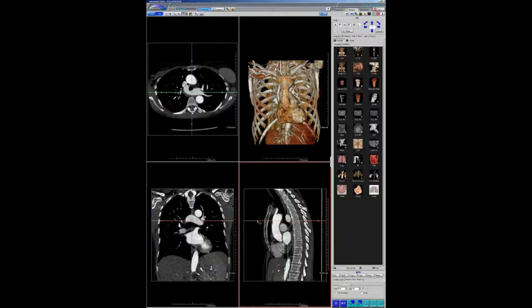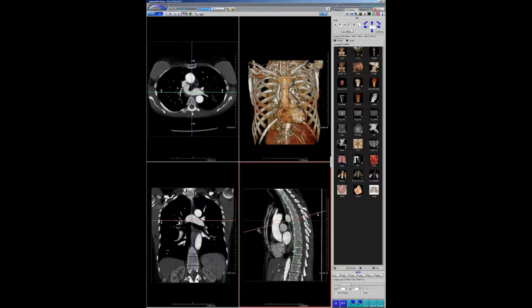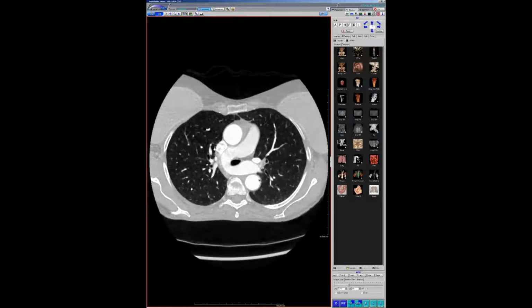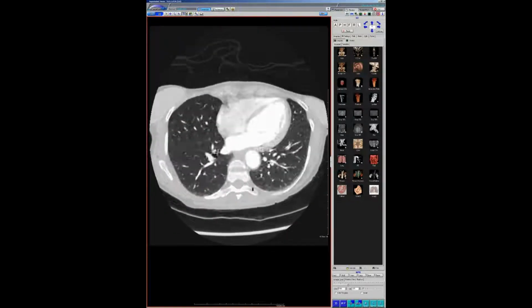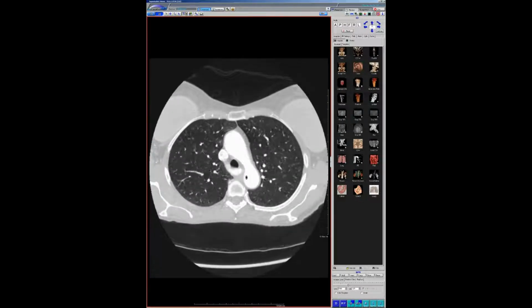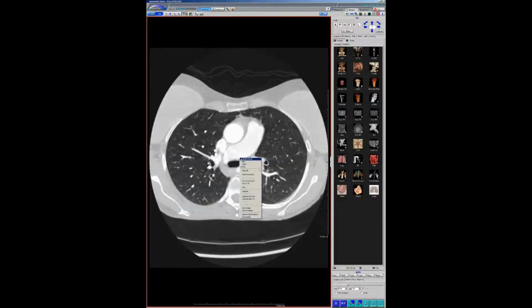So I haven't seen one in a few years, maybe 2 years now is the last time I saw one. So always cute to see the pulmonary sling. And like most people, it's an older patient. Does he have any airway anomalies? That's a good question. I didn't read this study, but let me look.